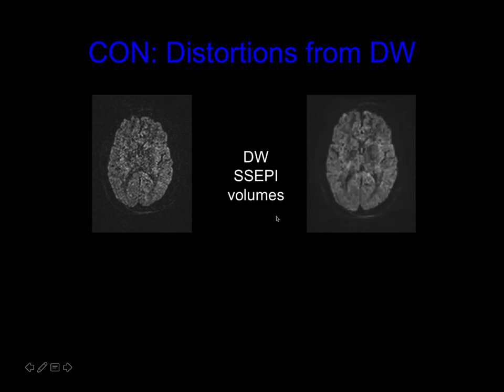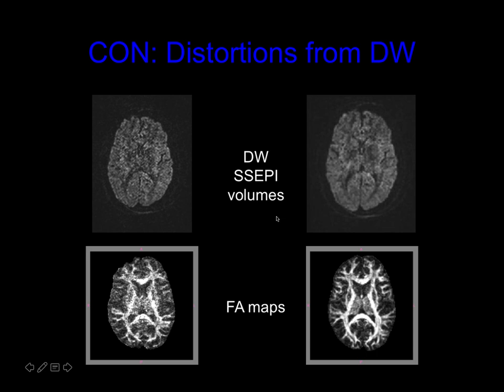Now you might think to yourself, does this really matter? Well, when we go to calculate the fractional anisotropy, for example, if you haven't corrected for that, then areas where you should have low anisotropy, like the gray matter, the anisotropy will be higher, and where you have high anisotropy, like the white matter, the anisotropy will actually be calculated lower. And so after correction, we get this. You can see that the gray matter is all nice and low fractional anisotropy. Much better.